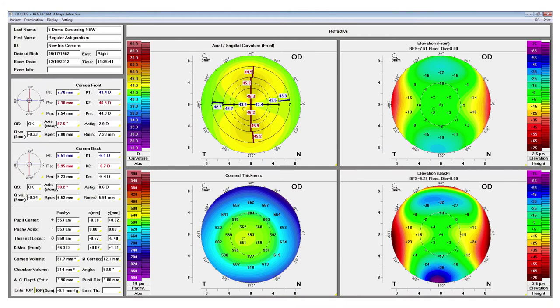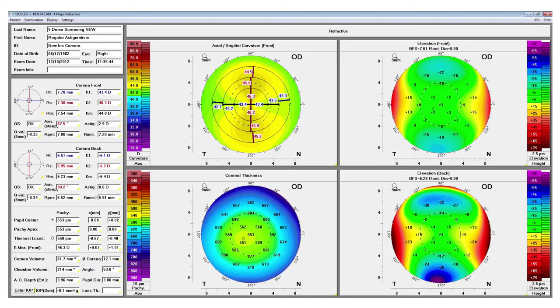Another popular display is our four maps display. This is a common configuration where we have the anterior curvature map, the anterior corneal elevation map, the posterior corneal elevation map, and the corneal thickness map. This is a common configuration, however you can select any four maps that you would like. This is an example of a patient with regular astigmatism. On the curvature map, you see the nice symmetrical bow tie shape. On the elevation maps, you see truncated figure eight pattern and on the corneal thickness map, you see good corneal thickness.